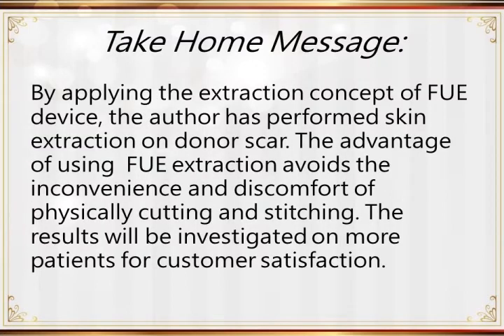Take-home message. By applying the extraction concept of FUE device, the author has performed skin extraction on donor scar. The advantage of using FUE extraction avoids the inconvenience and discomfort of physical cutting and stitching. The results will be investigated on more patients for customer satisfaction.